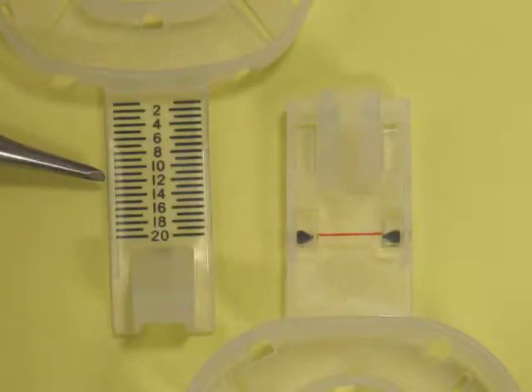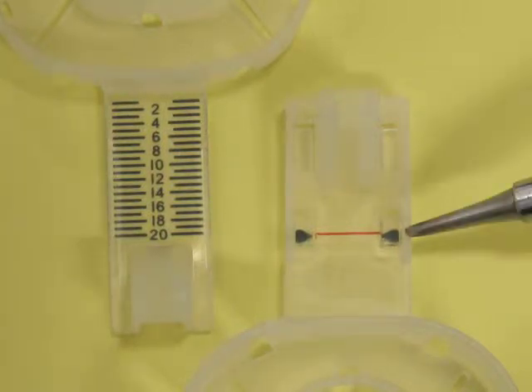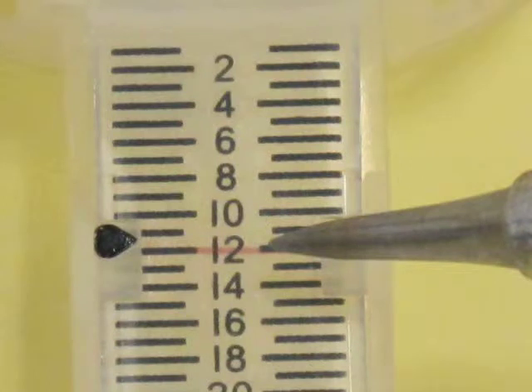The MATRx tray scale, graduated in millimeters, is located on the upper tray. The MATRx scale indicator, located on the lower tray, is the red line that runs between the lower tray indicators. The scale reading is verified by determining the position of the red scale indicator on the lower tray as it shows through the scale on the upper tray.